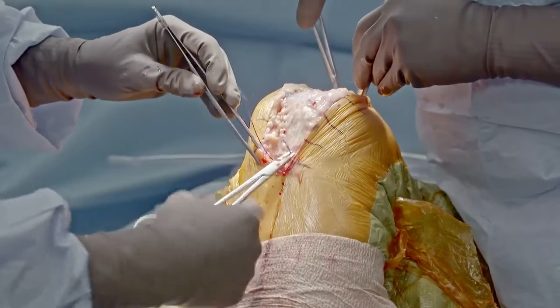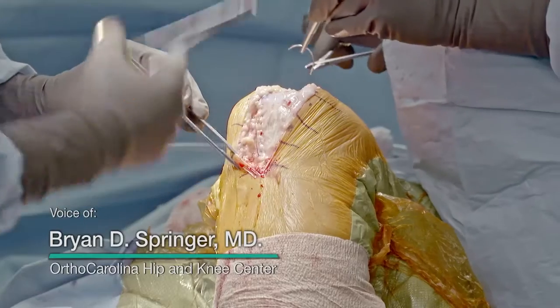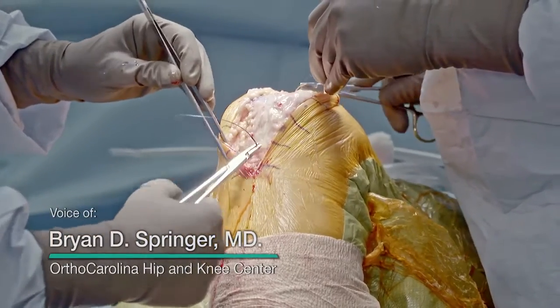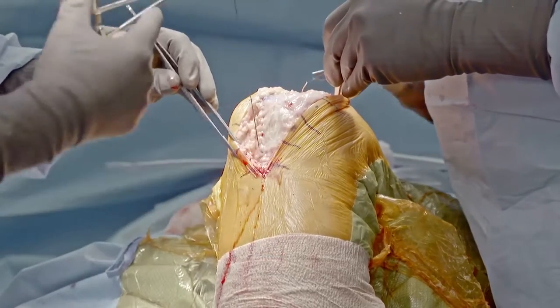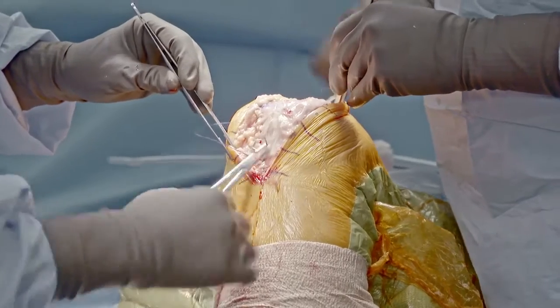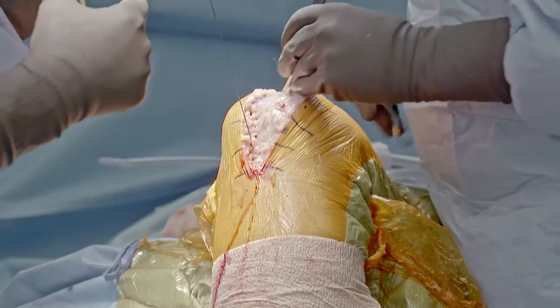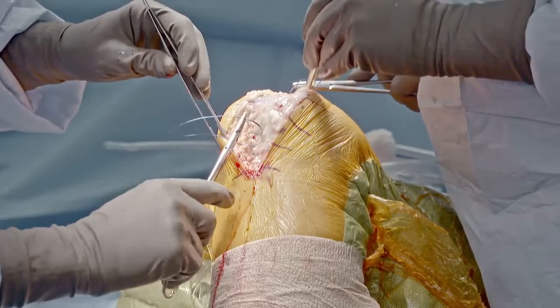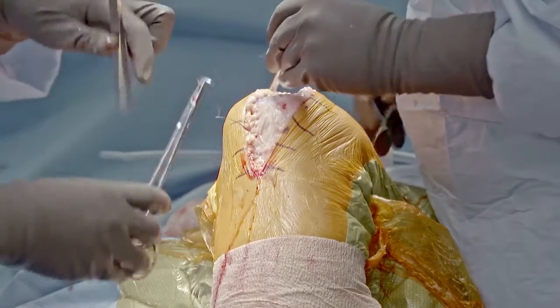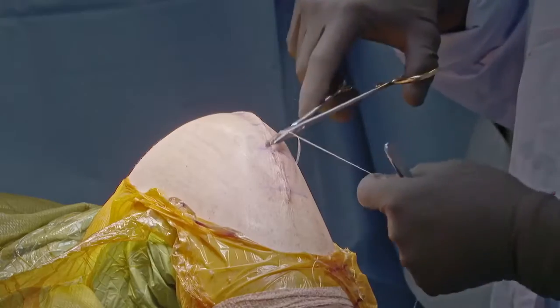It is important to obtain a watertight closure of the deep capsule of the knee to prevent drainage. We prefer to use a running barbed suture. The deep tissue and subcutaneous layer of the skin are closed with an interrupted suture, and the subcuticular layer with a running 3/0 Monocryl stitch to minimize the amount of tension on the skin.